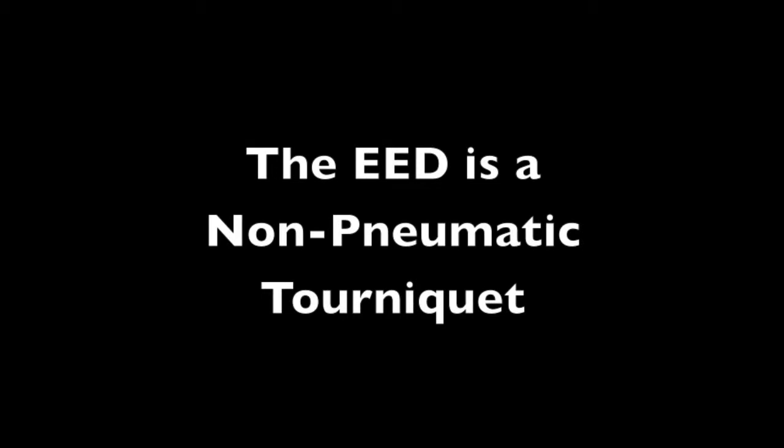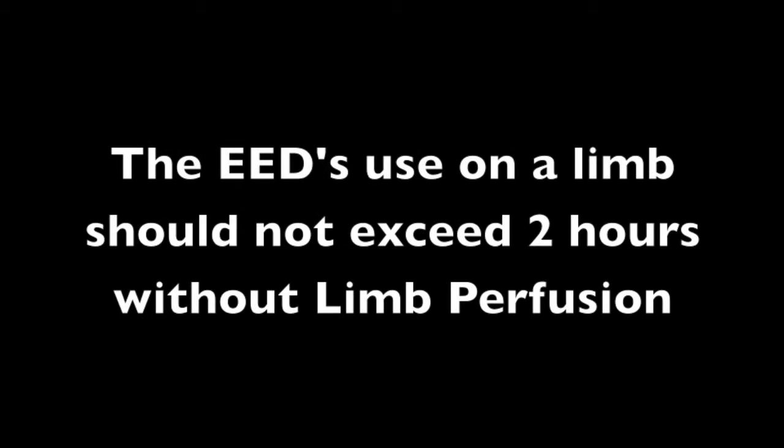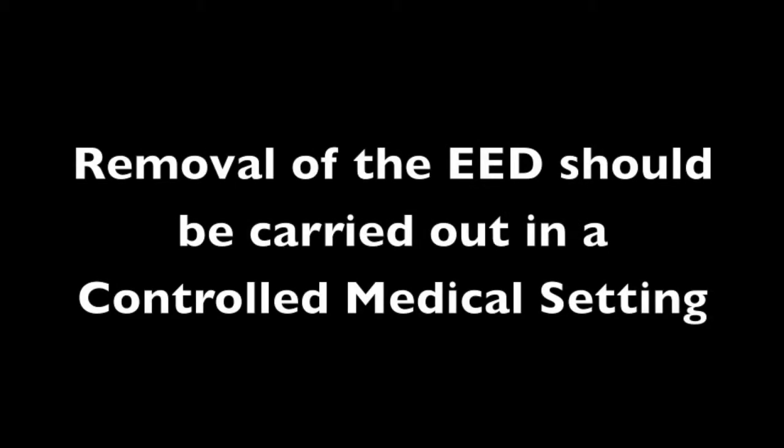In review, the EED is a non-pneumatic tourniquet and is indicated for displacing the patient's own blood from the limbs to the central circulation and blocking the arterial flow to the limb. The EED's use on a limb should not extend beyond 2 hours without limb perfusion. Removal of the EED should be carried out in a controlled medical setting. It should commence as soon as the patient's hemodynamic status has stabilized.